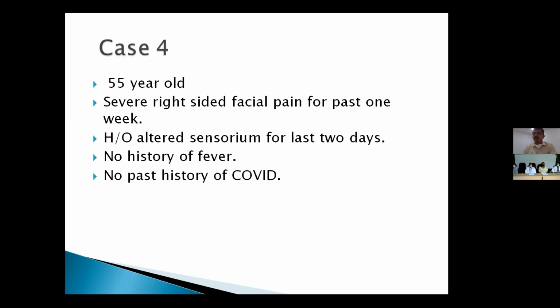So he came to Neuro Foundation. He had no past history of COVID also. He denied any traveling history. So a neurologist suspected right trigeminal neuralgia, some form of neurovascular conflict. We did an MRI for the patient.